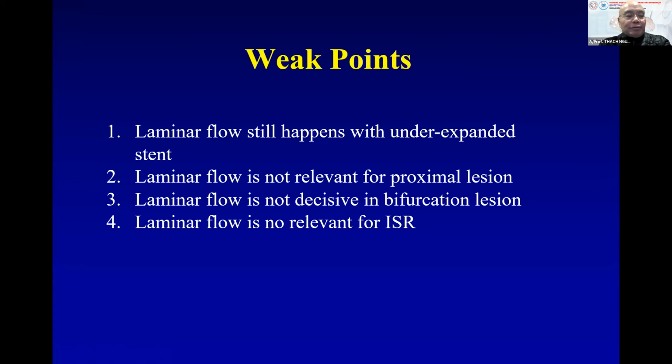Even so, I love to look at hydraulic fluid mechanics to explain how we do stenting. And laminar flow is the best flow, but I see that if the patient has an underexpanded stent, the patient can still have laminar flow. This is the problem I have now.